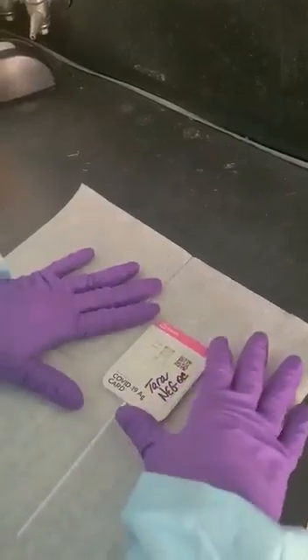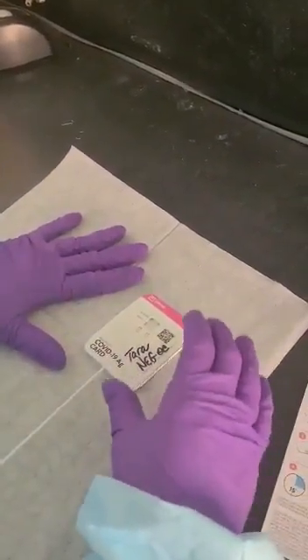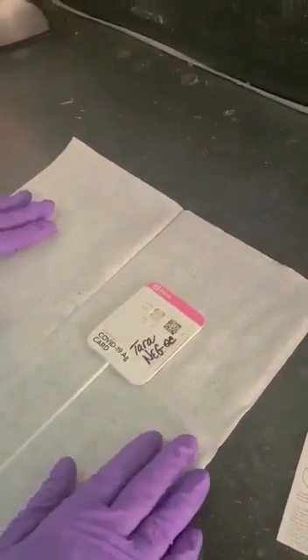Also, if you're not available to read it exactly at 15 minutes, they give you an additional 15 minutes. However, you cannot read it after 30 minutes total. After 30 minutes, you would need to repeat the test.